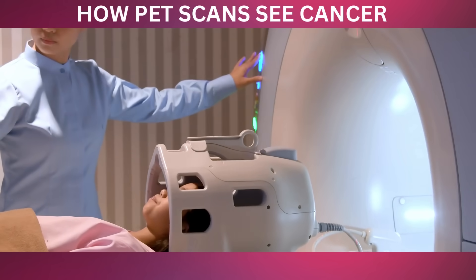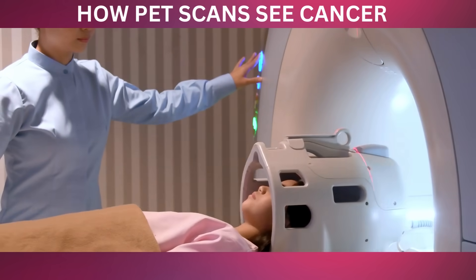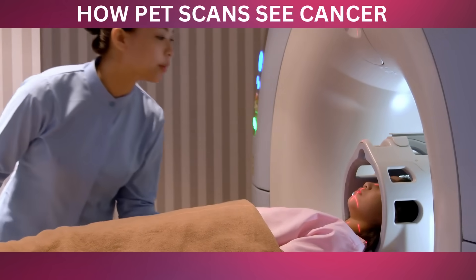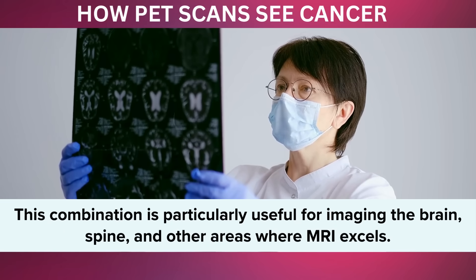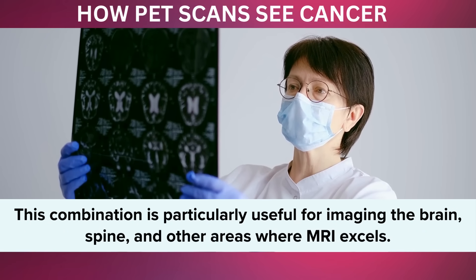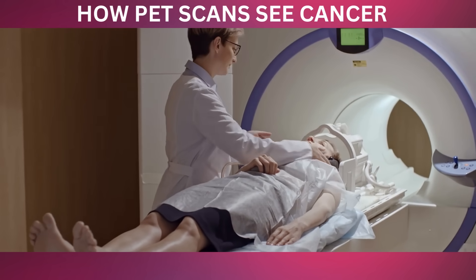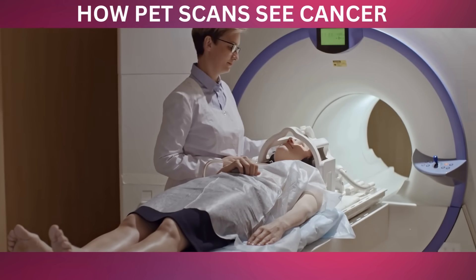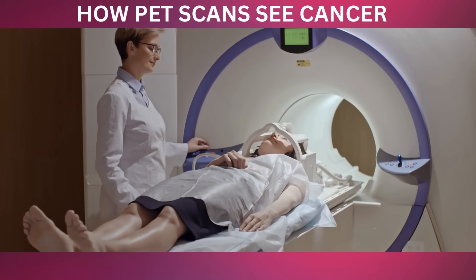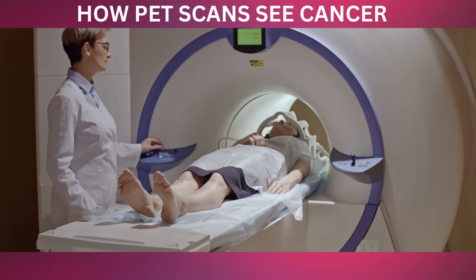Similarly, a PET-MRI scan combines the metabolic insights of PET with the high-resolution images of soft tissues provided by MRI. This combination is particularly useful for imaging the brain, spine, and other areas where MRI excels. PET-MRI scans are valuable in assessing the extent of cancer, planning surgeries or radiation therapy, and evaluating treatment responses, especially in cases where detailed soft tissue contrast is crucial.